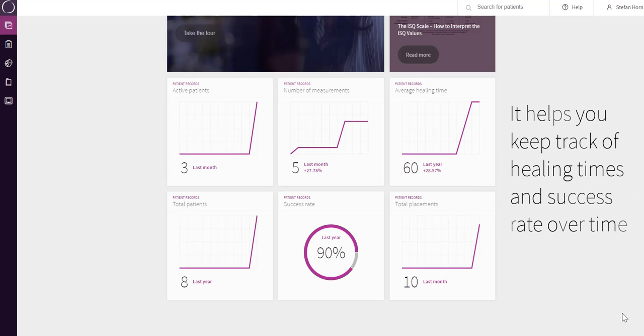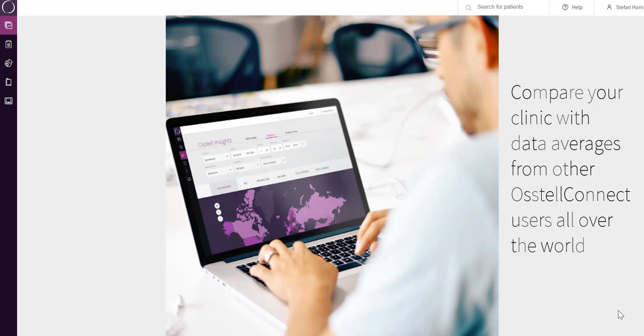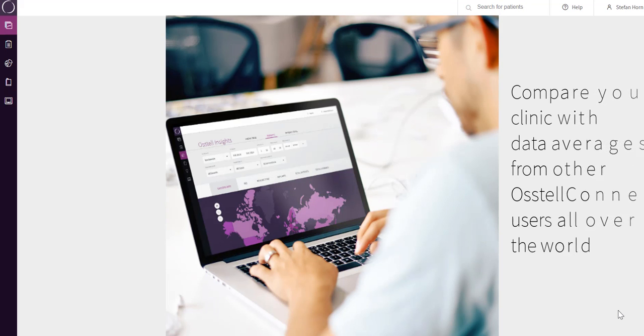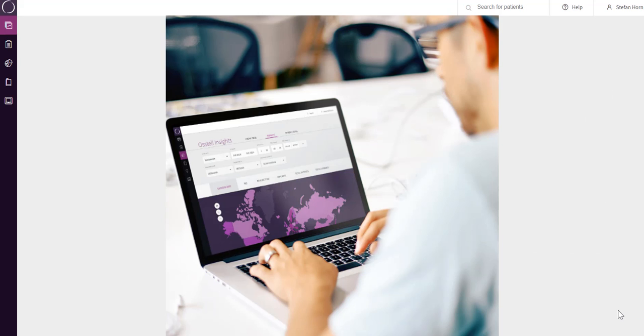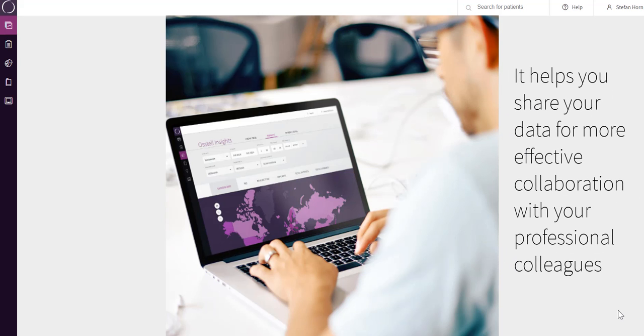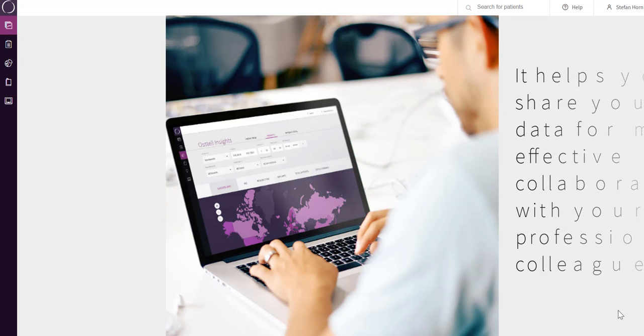It helps you keep track of healing times and success rate over time and to compare your clinic with data averages from other Austell Connect users all over the world. It helps you share your data for more effective collaboration with your professional colleagues.